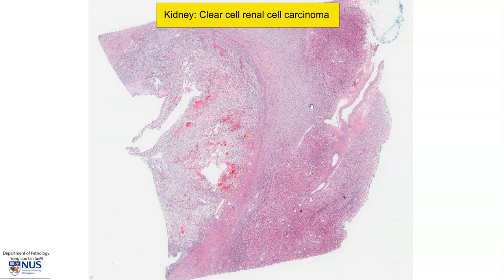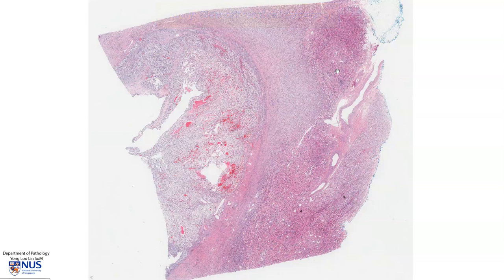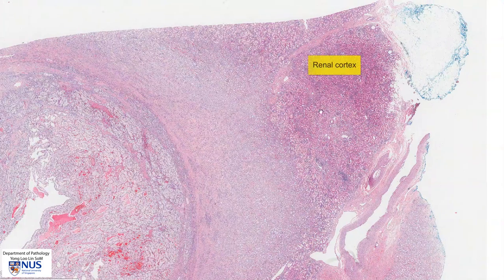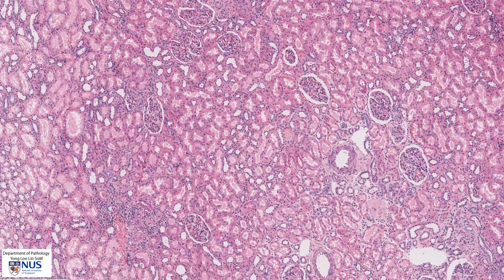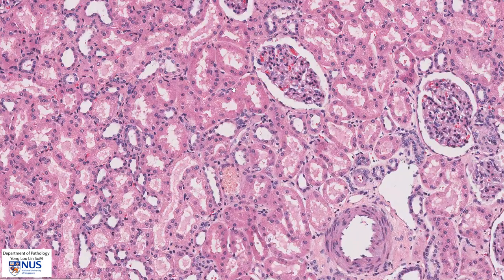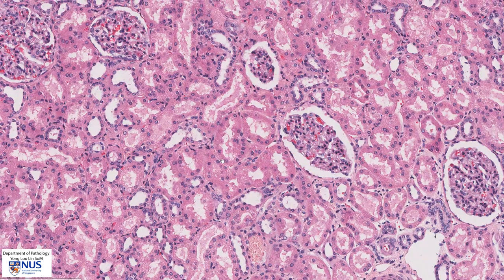Before we look at the tumor itself, which is located here, let's take a look at the non-neoplastic kidney. This is the renal cortex, and this is the medulla. In the cortex, we can see glomeruli and we can see some tubules, and these are parts of the proximal convoluted tubule. These are usually lined by cells with abundant dense eosinophilic or pink cytoplasm.